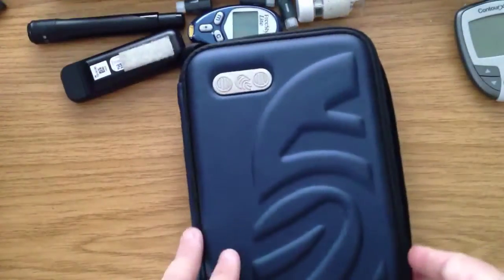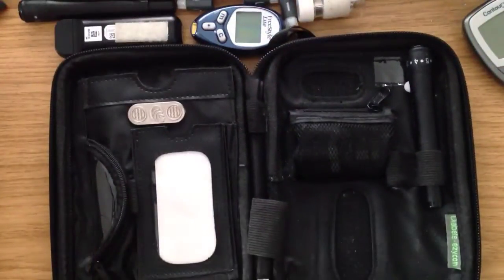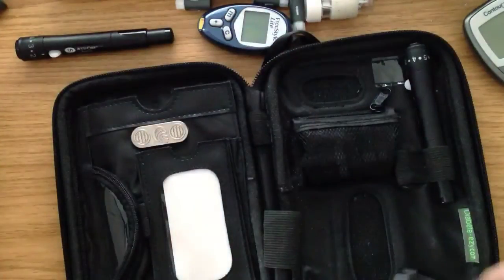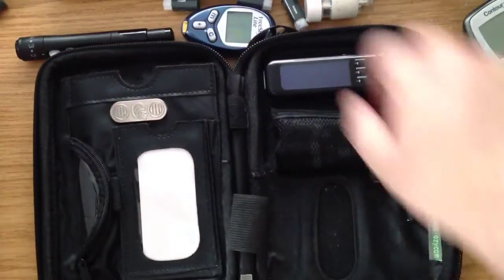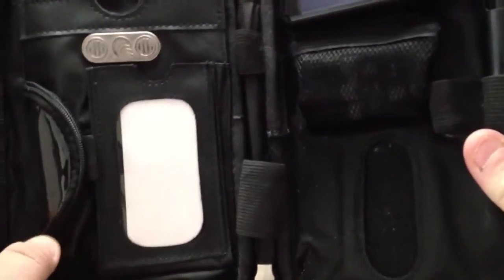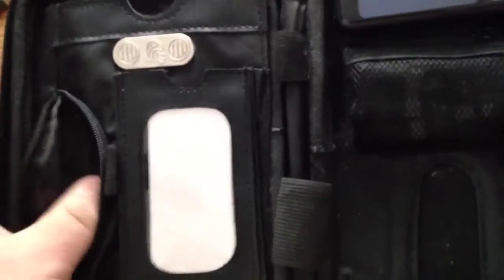And then comes the Diabetes Easy case. This is a case that I have used for a long time, and it comes in pretty handy. Here I've put a Velcro strip on the bottom, so I can just Velcro it in. You've got a finger prick pen. You could also put another meter here if you wanted to, or a test strip pot. You've got this little pouch that opens up where you can put test strips in, or wipes.